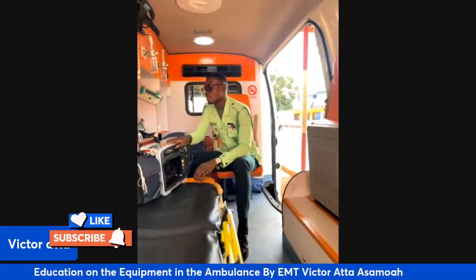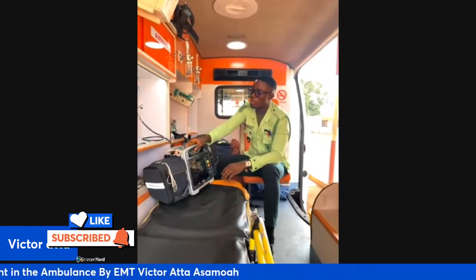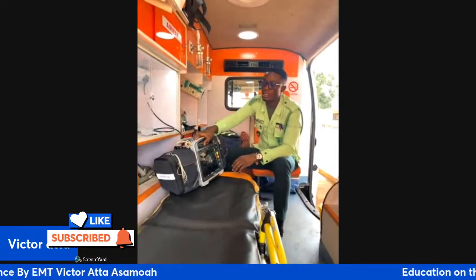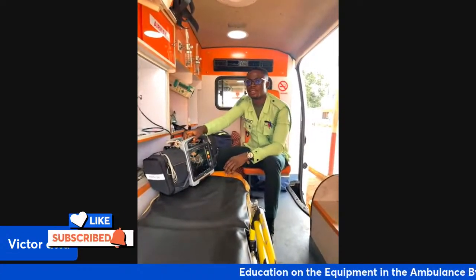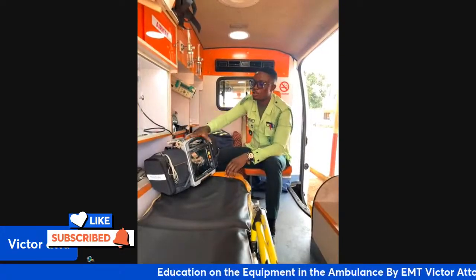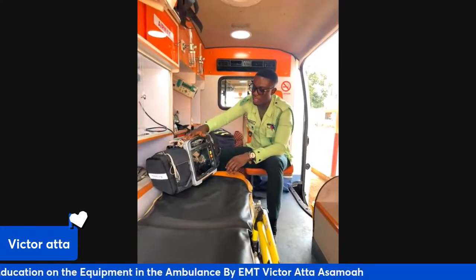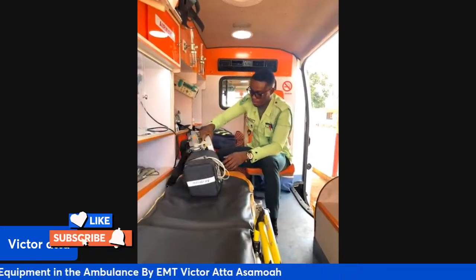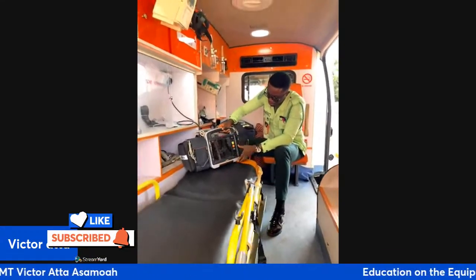It also serves as an AED or a shock device, for when someone goes unconscious and you want to sustain the patient or the client. It has the shocking parts and everything. So we'll turn it on to see the features.